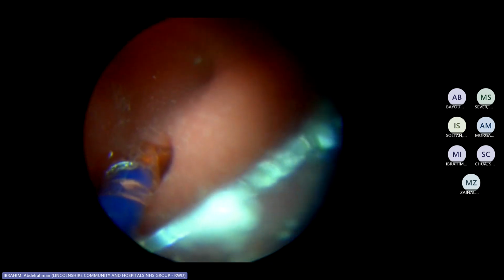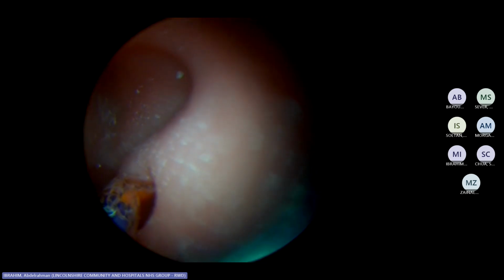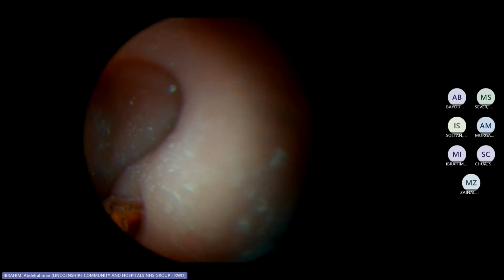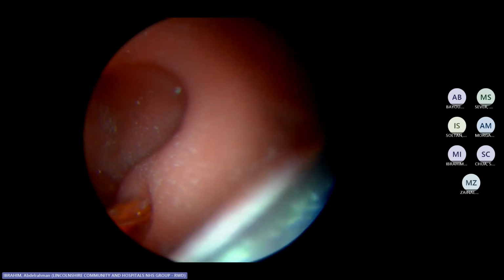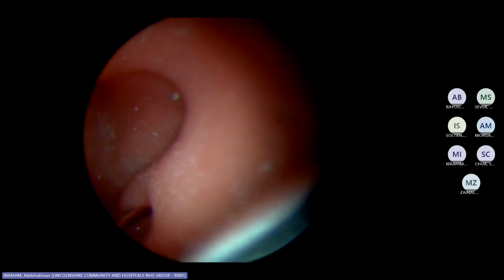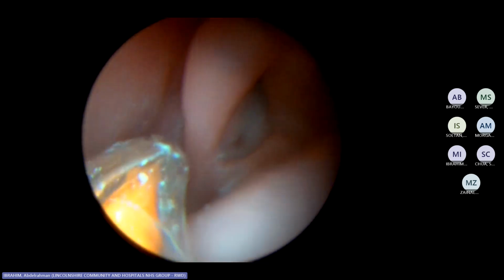We wait for the 2 minutes. Then I'm going to deflate, take this out, and go back. The trick here is to pull it out, so it's not that easy. You see, pull it out and then move again slowly.